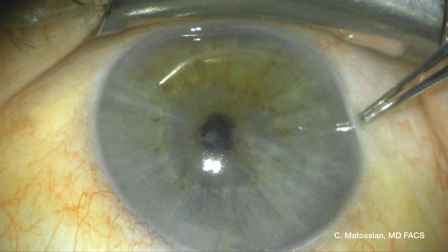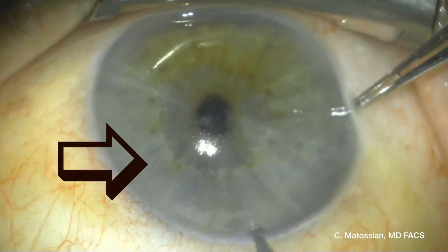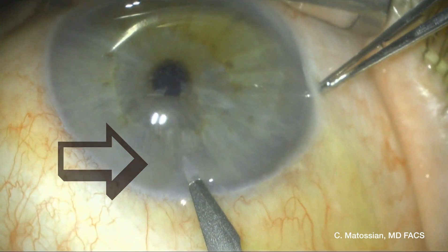This is a 63-year-old gentleman who underwent uncomplicated cataract surgery. At the four-week postoperative visit, I noticed a nuclear fragment in the angle at 6 o'clock.